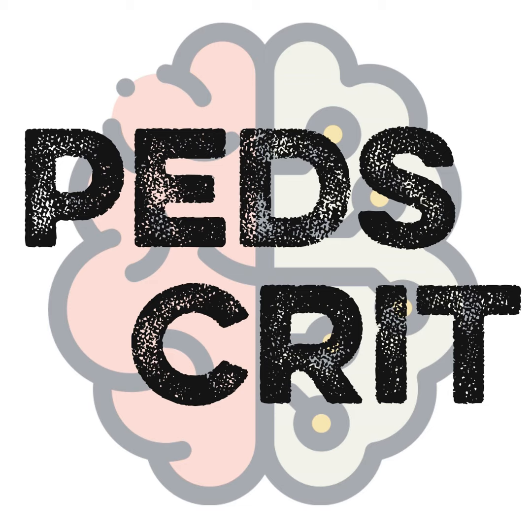It's always good to have these talks, right? Our surgeon always says you never over communicate. So always having that planned discussion with the surgeons too, right? I don't want the phone call to be like, hey, I need ECMO right now. Having those anticipated talks with the surgeons, hey, this is going on. I think I'll be okay. But having a timeline too, like, hey, we're going to wait the next 2 hours and see where this is going. And if by 2 hours you're not seeing any difference, then probably it's time to go on. So I think having those conversations is very helpful. Being proactive would be the key. Yeah. Thinking about it early, so everybody knows to be awake and maybe in the building.